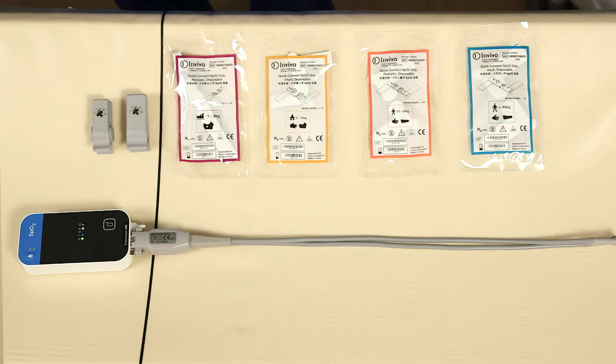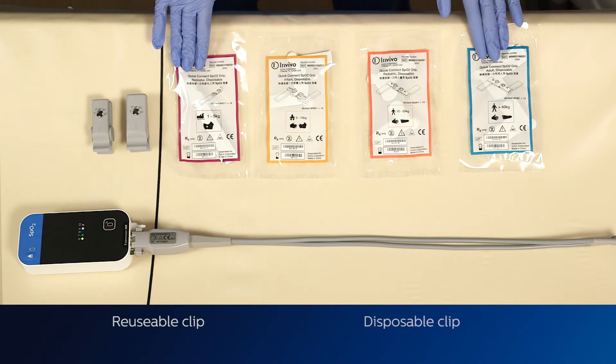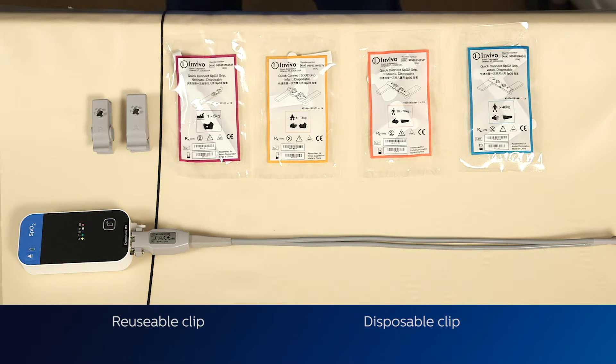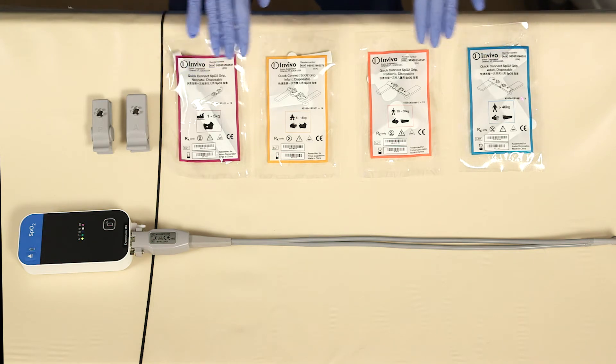Before placing the SpO2 module on the patient, choose which clip you would like to use. There is the reusable clip and the disposable clip. If you decide to use the disposable clips, make sure to select the appropriate size. There is a neonate and adult disposable clip, as well as infant and pediatric.